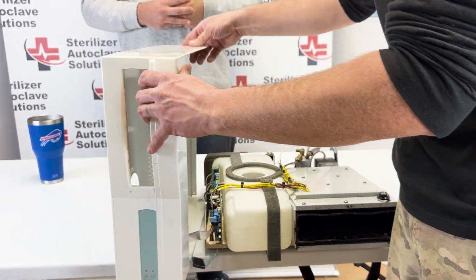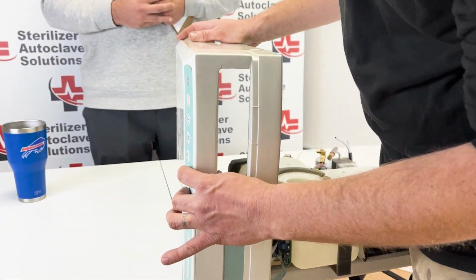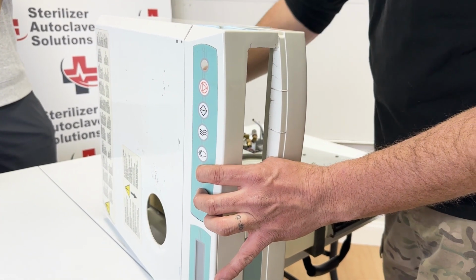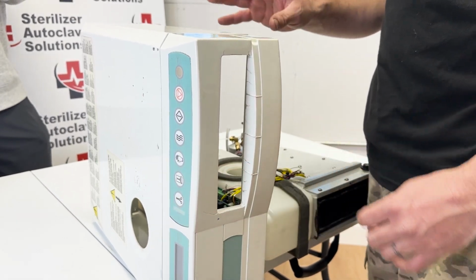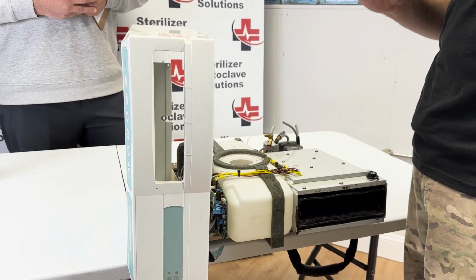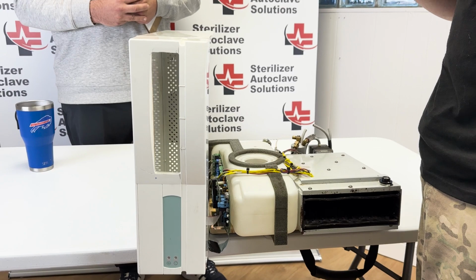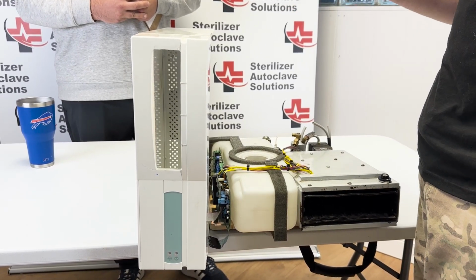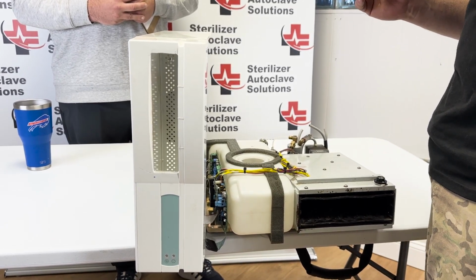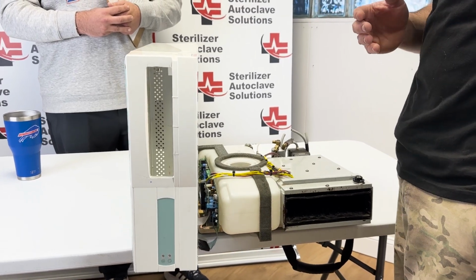And now with the unit off, I'm going to press and hold my first 2 buttons, my unwrapped and my wrapped, and turn it on. And when you turn it on, you will see you have a high end and a low end. Your low end, if it is set to 30, you can drop that down to 10. In this customer's case, they had water, it was saying refill reservoir, empty wastewater. So they had water in here. Their water quality, what they were buying from the store, it was at 15 parts per million. So it was too clean and it was not registering.